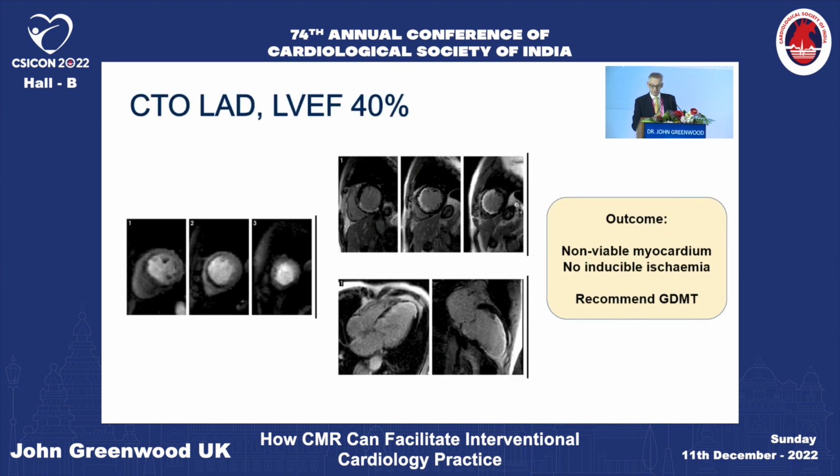Here's another scenario, similar, CTO of the LAD. This time we can see there is evidence of hypoperfusion in the LAD territory, in the septum and the anterior wall, but it pretty much matches exactly where the scar is on the late gadolinium enhancement images.